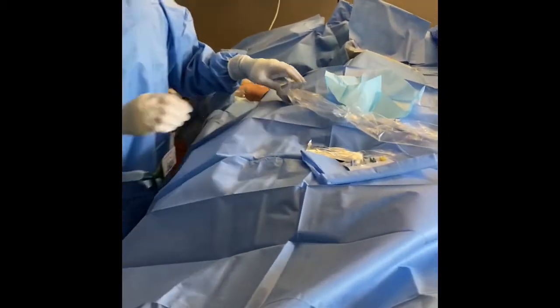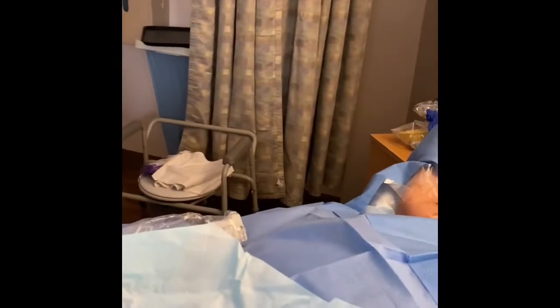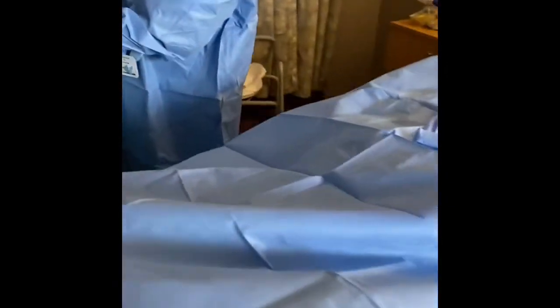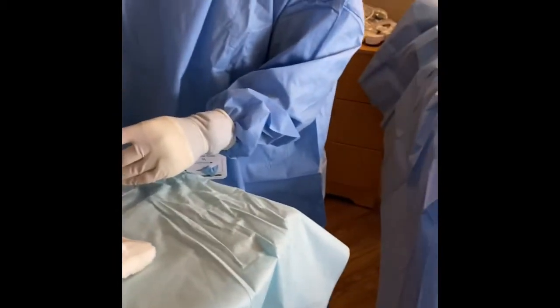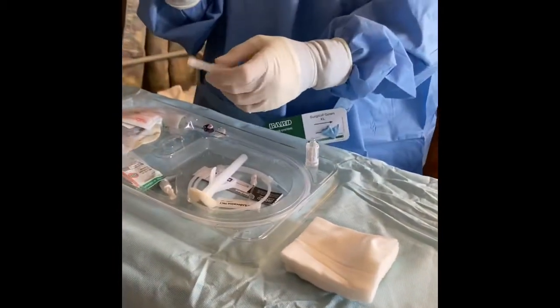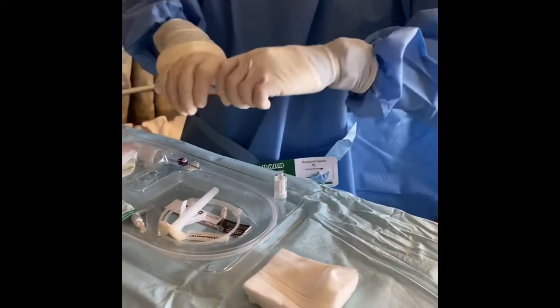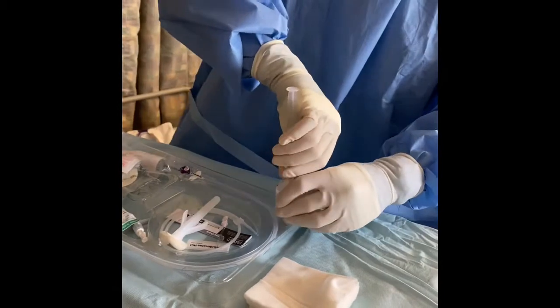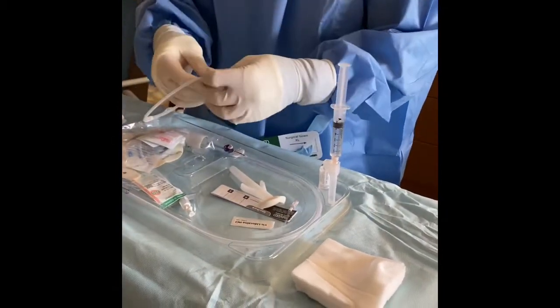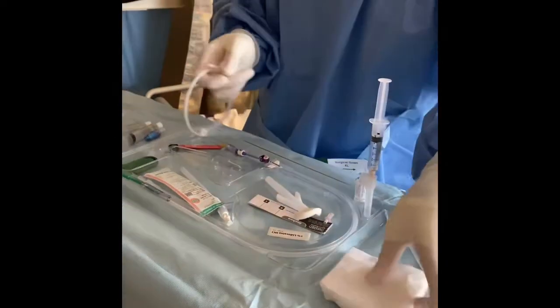Don't get nervous, ma'am. The only time you're going to feel pain is when we put the numbing medicine — it's a sting and a burn. Otherwise the rest of the procedure is painless. It's going to burn a little bit. Now he's preparing the lidocaine. How long does it burn? Just a few seconds, actually. So he's getting ready — get ready on your fives.